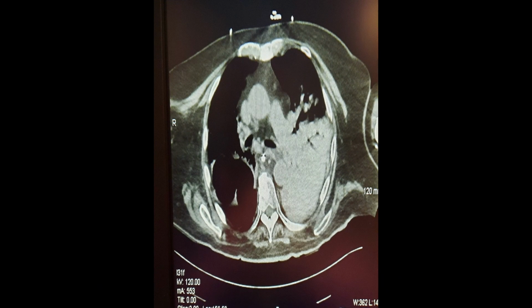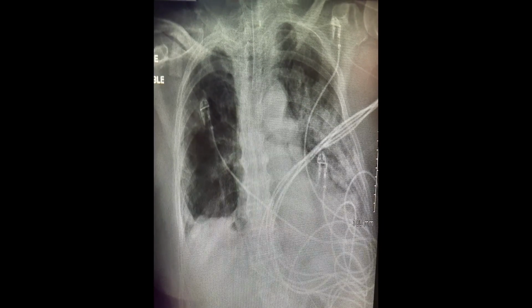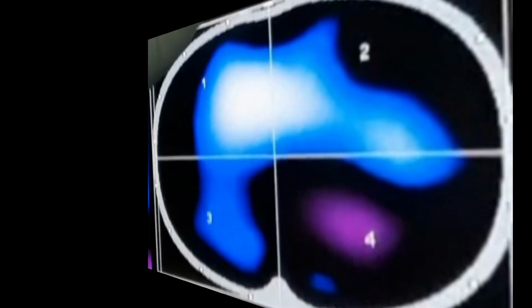So with the saturation at 75% on an FiO2 of 100, the doctors asked that the PEEP, as a last-ditch effort, be increased to 20. This is in correlation to the ARDSNet table that titrates PEEP often in relation to FiO2 requirements. Thank goodness we had the PulmoVista, where we could increase the PEEPs and at least get some feedback to give us more confidence where to set that PEEP.